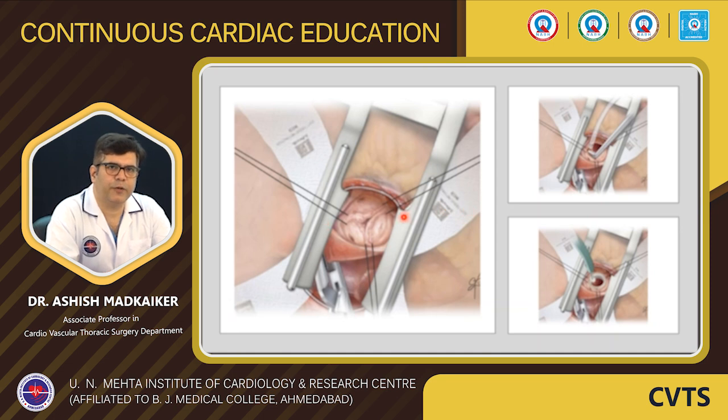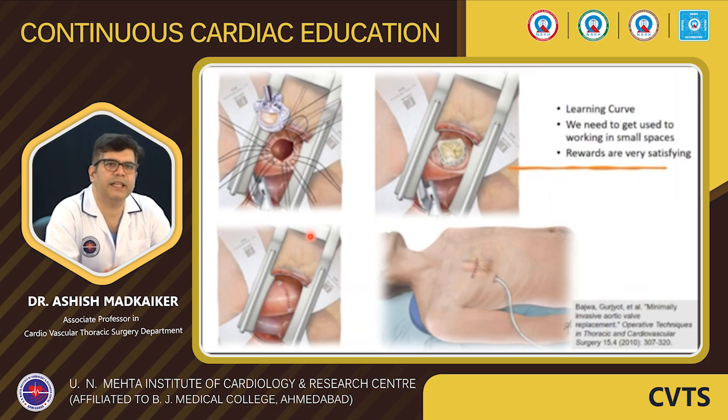Usually a transverse or oblique aortotomy is appropriate for this surgery. A good exposure of the aortic valve is important, which can be achieved by taking commissural stays, and again a good amount of stays on the aortic wall. Thorough excision of the valve and thorough debridement, then sizing of the valve, and taking appropriate stitches, and then anchoring the valve at the annulus, and closure of the aorta, and this is the end result.